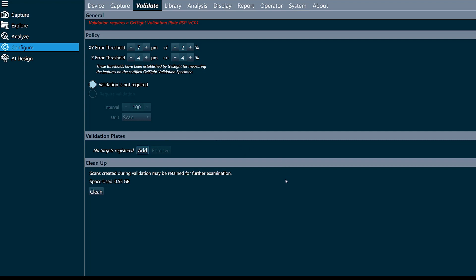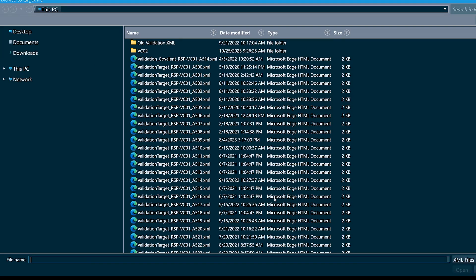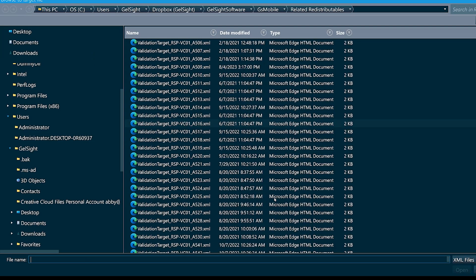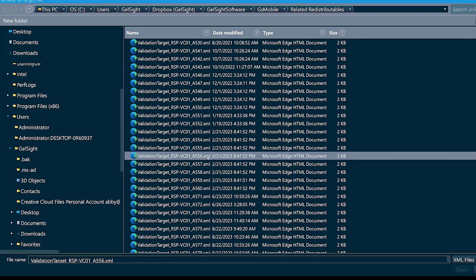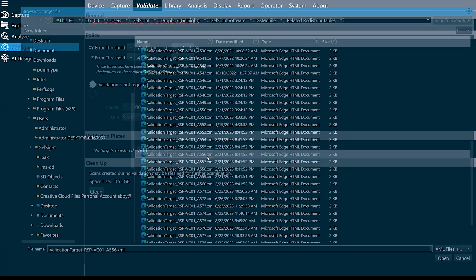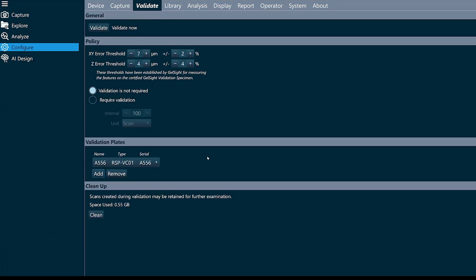If you need your XML files, you can reach out to support at gelsite.com. Next, I'll adjust my policy if necessary. The default thresholds in there are the minimums recommended by GelSite, but if your application allows for larger tolerances you can increase these numbers.